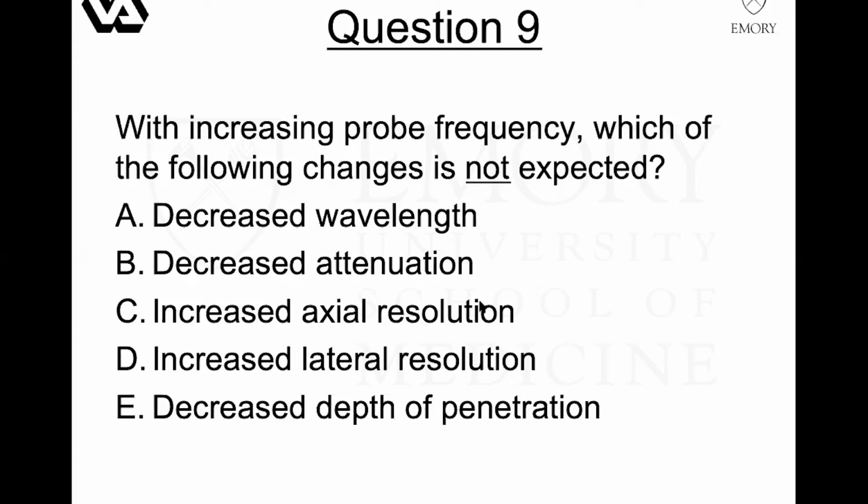So, Ankit, this is a question for you. With increasing probe frequency, which one of the following changes is not expected? Decreased wavelength, decreased attenuation, increased axial resolution, increased lateral resolution, and decreased depth of penetration.